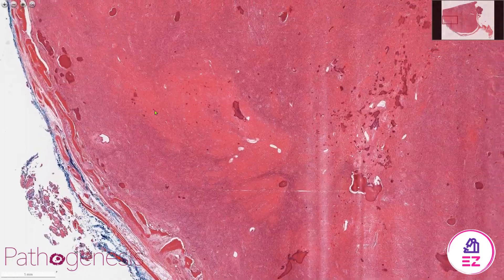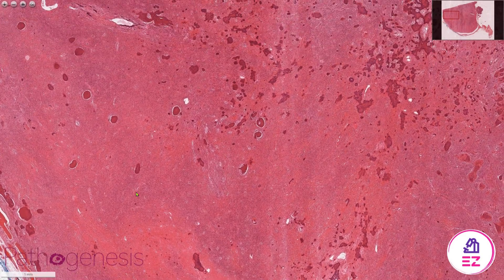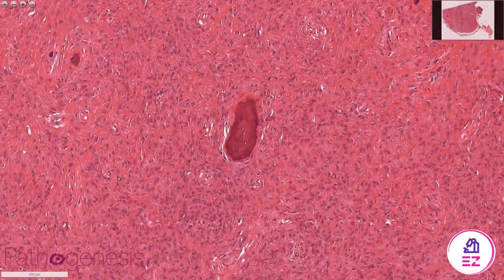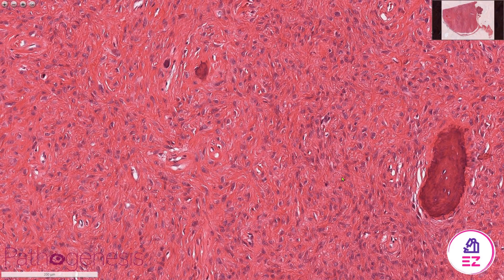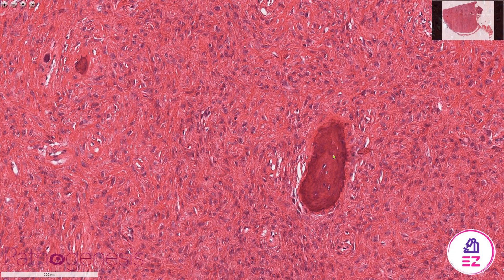The actual tumour will show variable cellularity, so there might be areas that are very hypercellular and areas which are hypocellular, and also the quality of the mineralisation varies throughout the lesion. Zooming in, we've got this rich fibroblastic stroma and within that we've got areas of calcification.